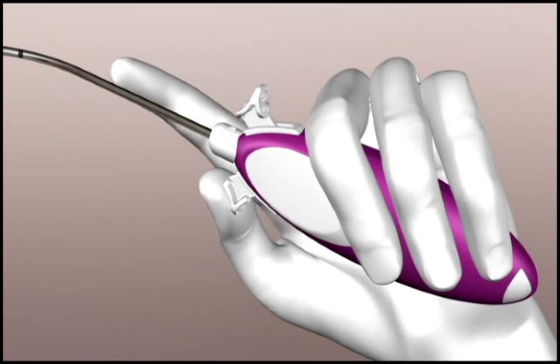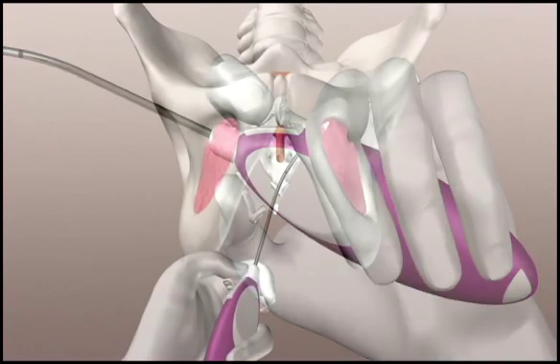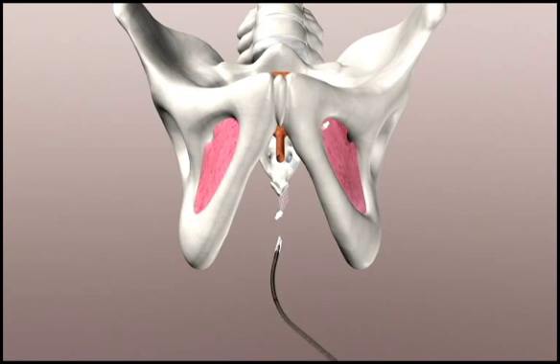To release the sling tip, pull back the slider on the handle using one or two fingers. Keep the slider depressed while removing the needle.